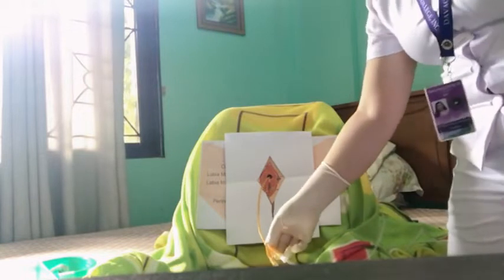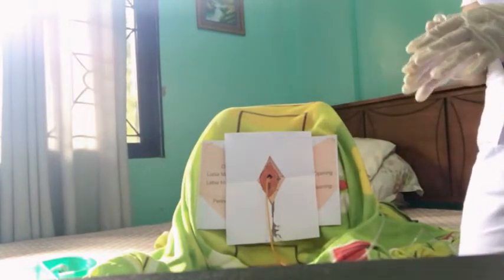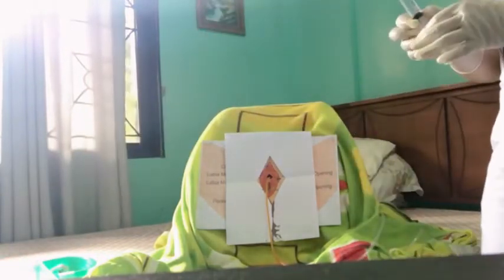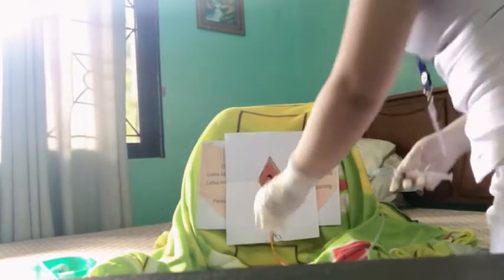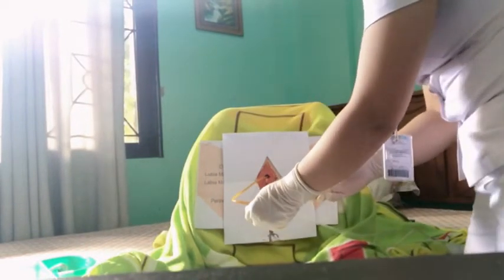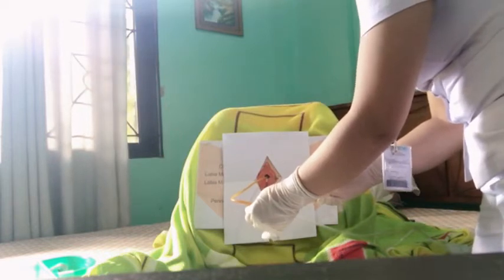Inflate the balloon with 10 to 15 cc of sterile water using the syringe. Make sure that there will be no leakage of water from the balloon. Thus, it serves the purpose of anchoring into the bladder. So secure it, and remember, no leakage of water.